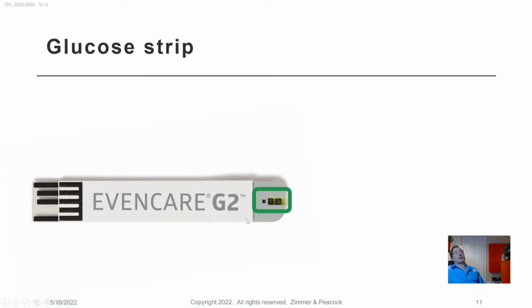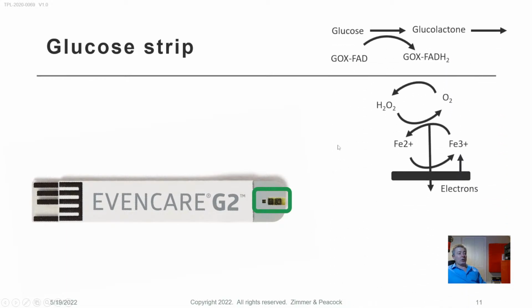So this inquirer is asking, I want to repurpose a glucose strip. I think to be honest with you, rather than trying to repurpose a glucose strip and use a glucose meter, I suppose I should say, the chemistry that I think is on there is glucose oxidase and some ferricyanide. And we have discussed that this morning. If you want to repurpose a glucose strip, you could try wicking in some choline oxidase solution and just letting it dry back in the strip.